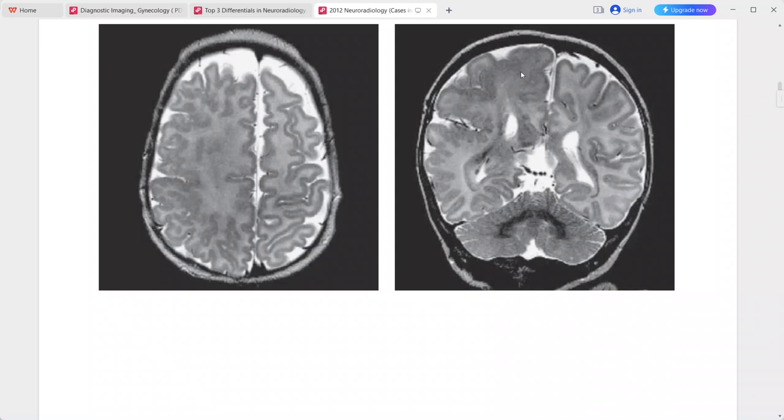The main diagnosis is hemimegalencephaly of the right cerebral hemisphere. Differentials include gliomatosis cerebri, hemiatrophy of one hemisphere as seen in Rasmussen's encephalitis, and tuberous sclerosis.